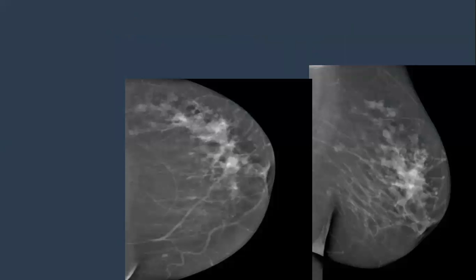This is an example. This is my neighbor. I remember the case. She had pain. What about the distortion here?